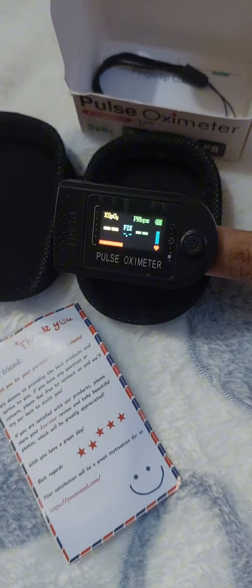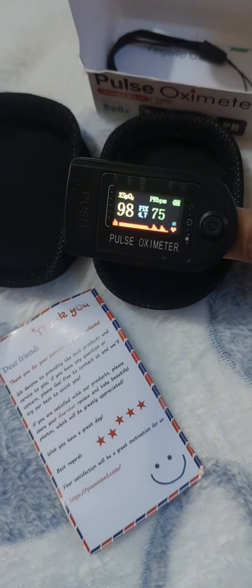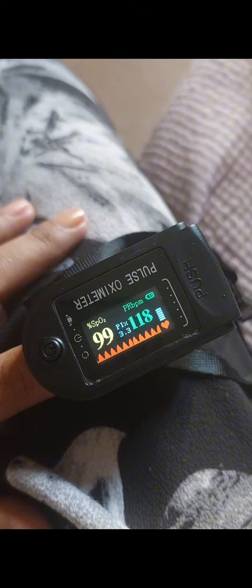At the top left, SpO2 is a measurement of how much oxygen your blood is carrying — that should be between 96% to 99%. At the top right is the PR bpm, which is the pulse rate beats per minute, and it should be between 50 and 90 beats per minute.